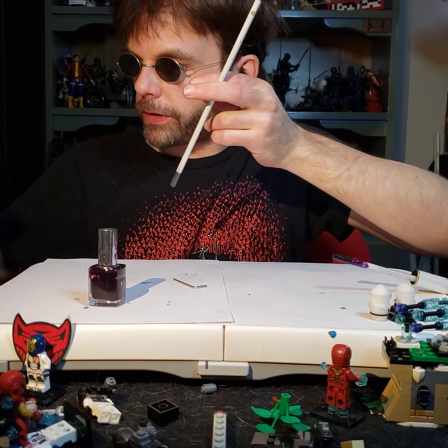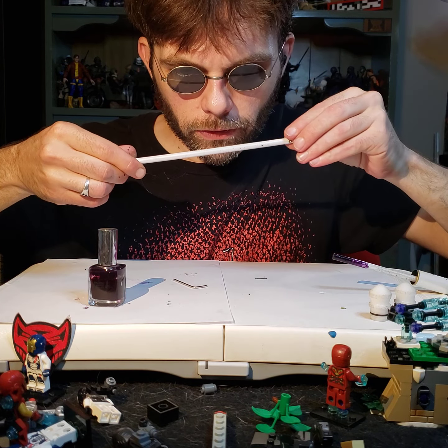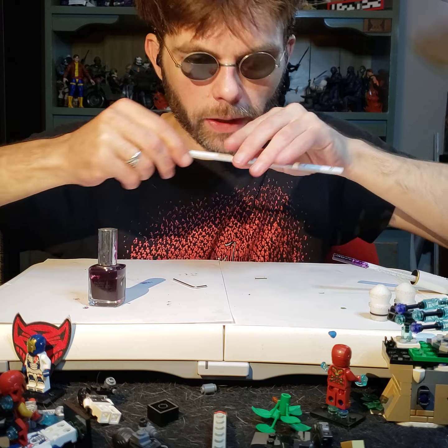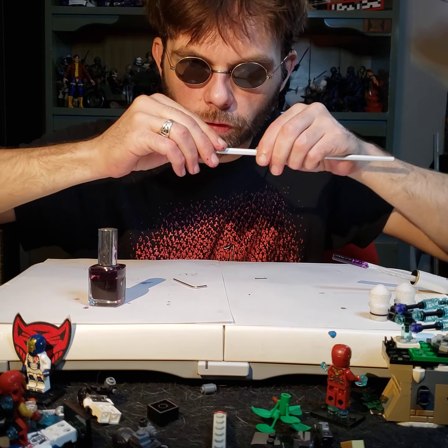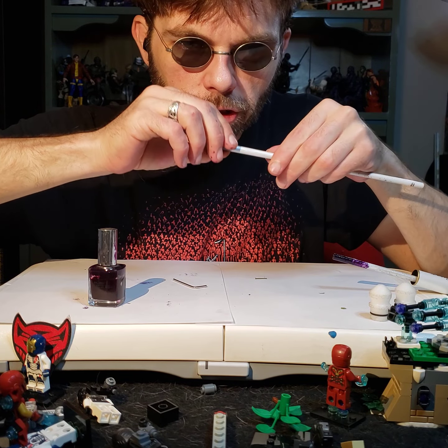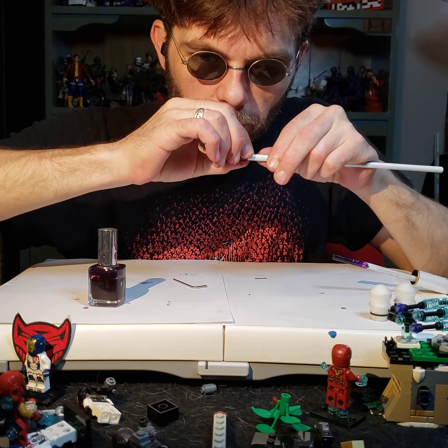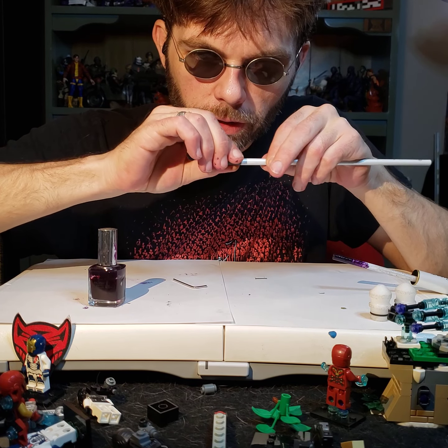And let's set the rear of the cane down. And now let's find the end that... Okay, so this is the end that goes into the tip because I can feel where the screw is bit into the carbon there. So we're going to come over to the other end. And once again, this one has been smoothed by the passage of water and sand and dirt and mush. In Florida, a lot of things get in your carbon fiber collapsing cane, and you need to clean them out. And this is why you never leave a carbon fiber collapsing cane just hanging out, because you don't know what could try to move into it here in Florida.